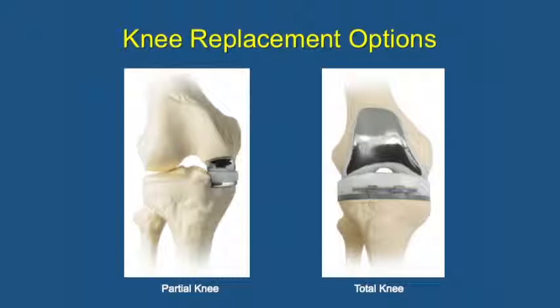What's important is if your surgeon's honest with you about why they use the device they use, if you bother to ask that question. Are they financially motivated to do so? They have to legally and ethically declare that to you. Or are they most comfortable with that implant? I tell you the reason I use the implant I use, it's what I grew up on. That's what I know. I know how that knee is supposed to feel.